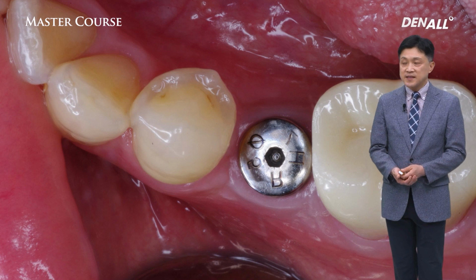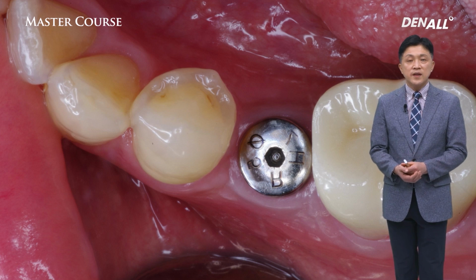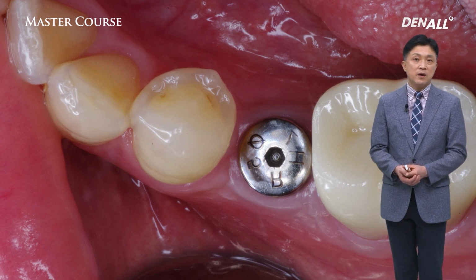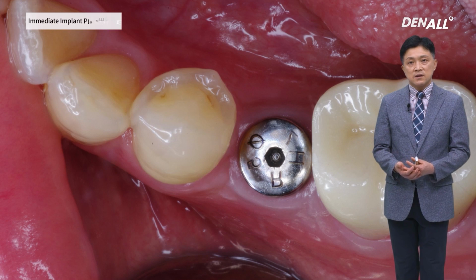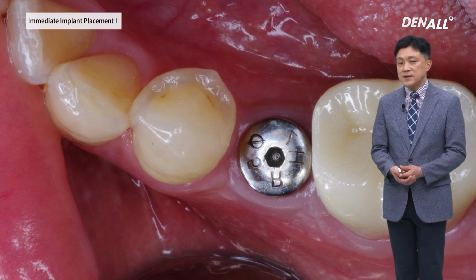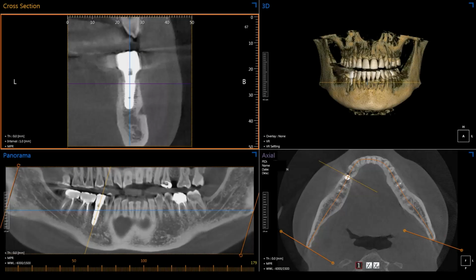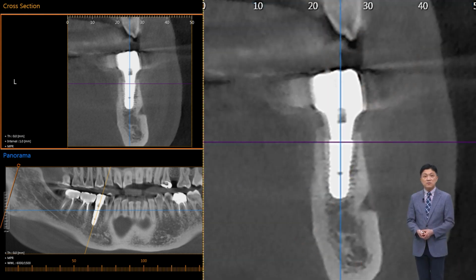This is after healing. In general, if there's good primary stability or a small gap, healing takes about 2 months. If there is a big gap or bad primary stability, I wait about 16 weeks before I deliver the final prosthesis. The prosthesis has been delivered. These processes are the same as the general implant treatment process. This was how it was completed. This was the process of immediate implant placement.